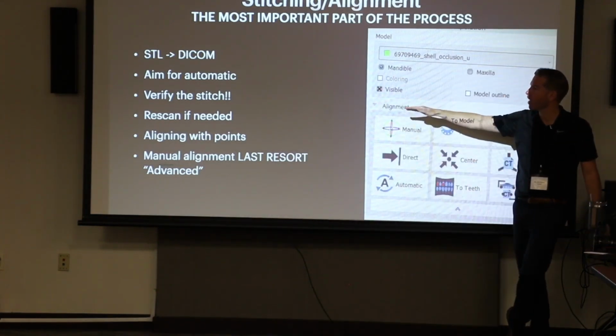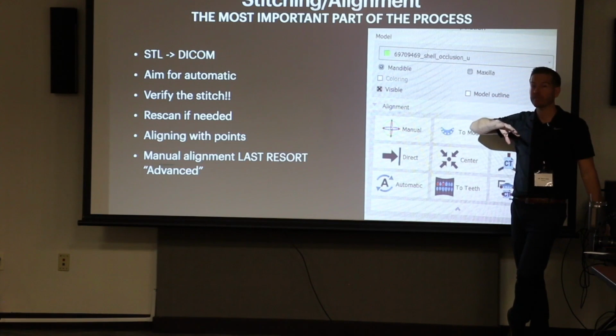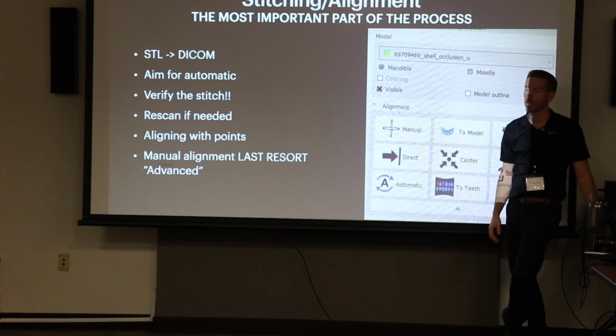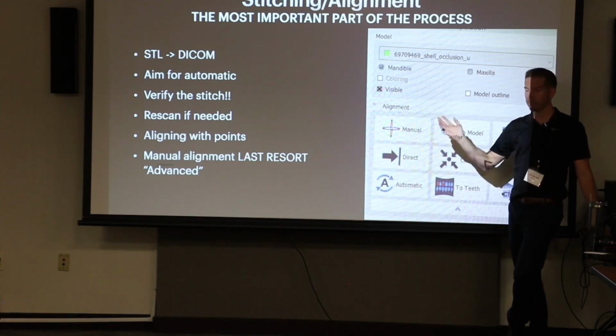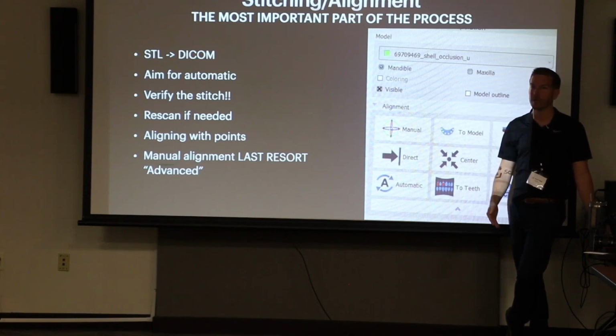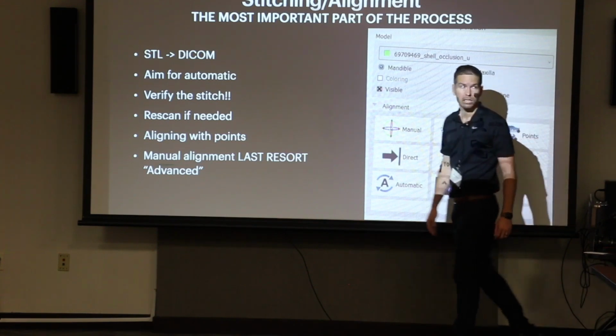We have to verify if our scan was poor, or the STL came out wrong, or there was movement in the patient when they were taking the CBCT. Don't just keep going. Stop, be predictable, rescan the patient, do it correctly if you want to continue. Don't be afraid to call them to come back.